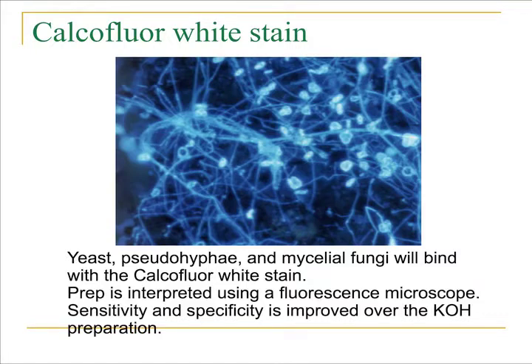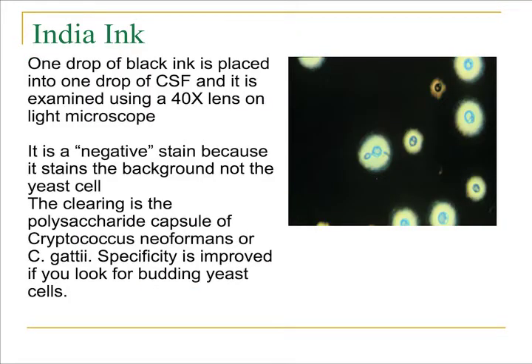On the next slide is the India ink prep. This is also a decade-old preparation, but still can be useful, particularly if your medical center has a large number of HIV patients, because as you know, the Cryptococcus neoformans is one of the main infections of HIV individuals.